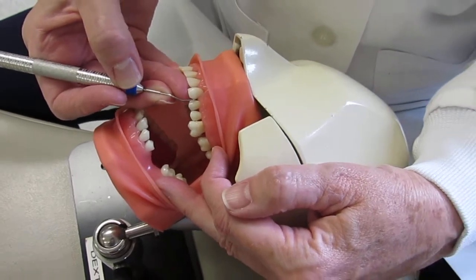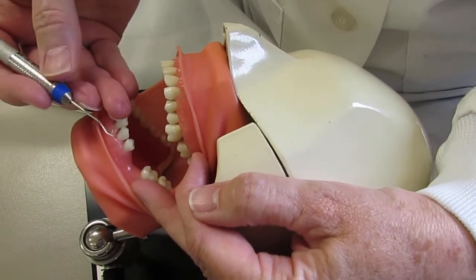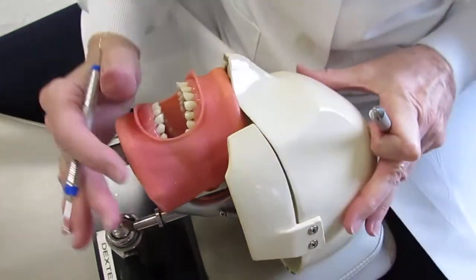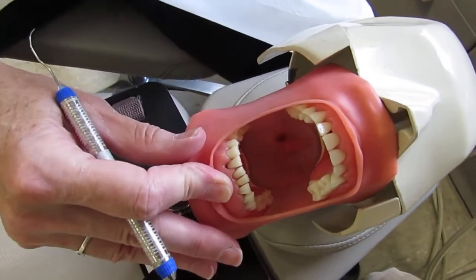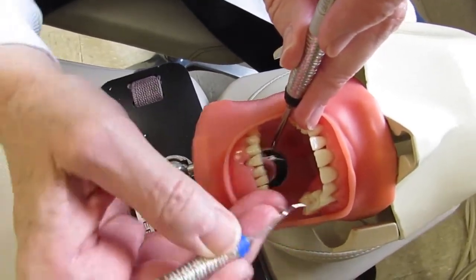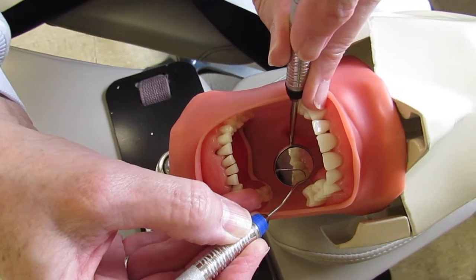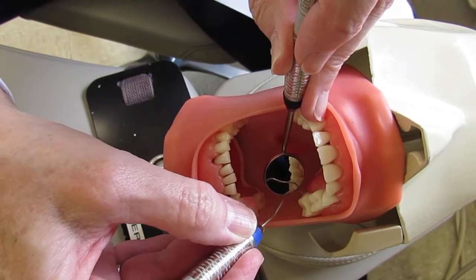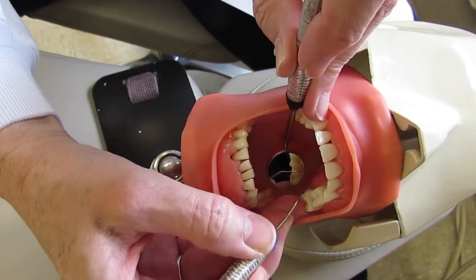To do the lingual aspect of this sextant, flip to the opposite working end, change the patient's head position by turning their head away from you, and use the mirror to see the distal. Since the instrument is already flipped, look in the mirror, go right to the distal, close for insertion, and walk. Getting on the maxillary arch requires adjusting the fulcrum position.